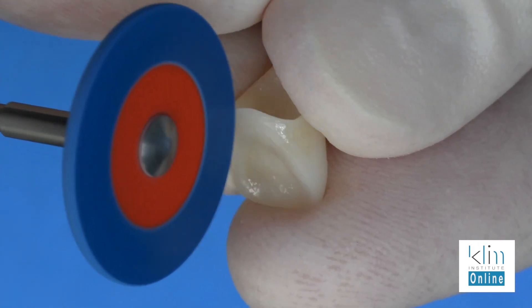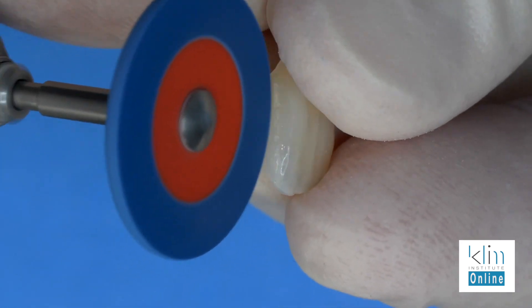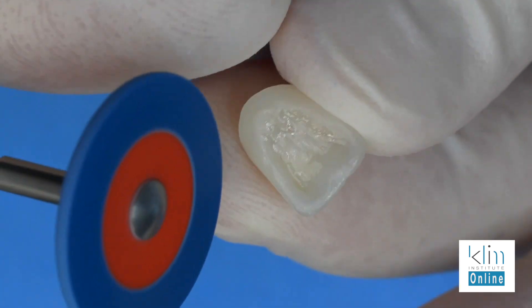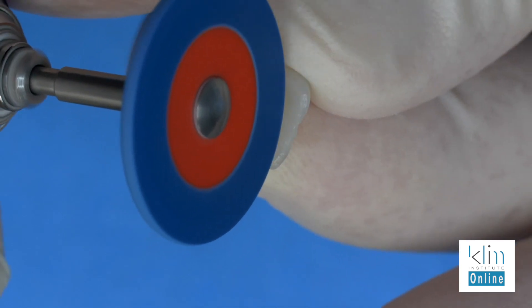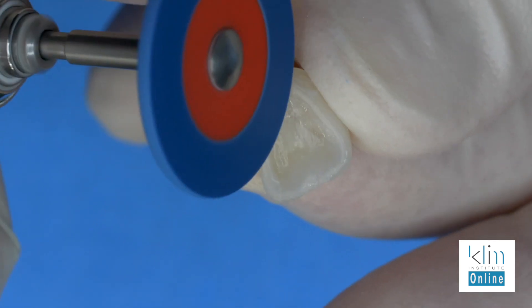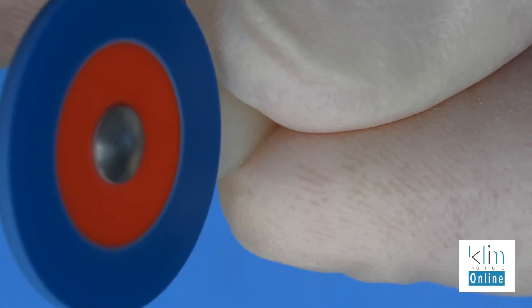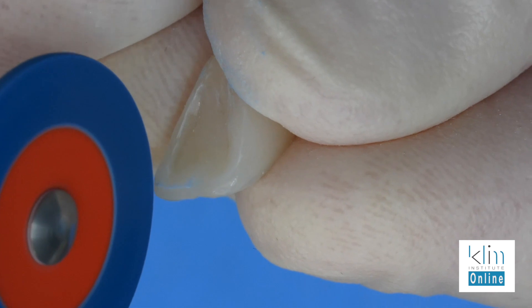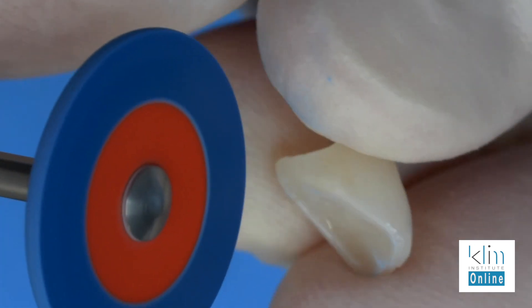Now we'll go to the lingual. Polishing any areas that will be near the soft tissue — we want those really smooth. It's important to polish the lingual of the restoration. We've added some glaze; we want that glaze very smooth. And the incisal edge — lightly bevel the incisal edge. This creates better protrusive function on that incisal edge and the line angles.